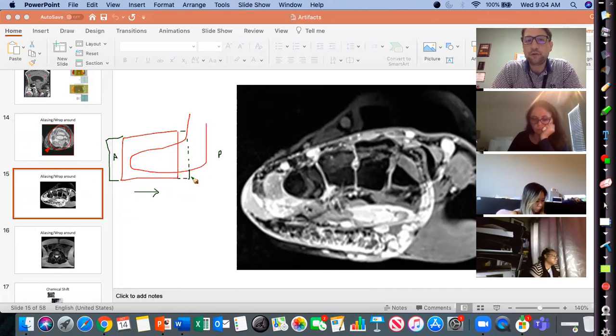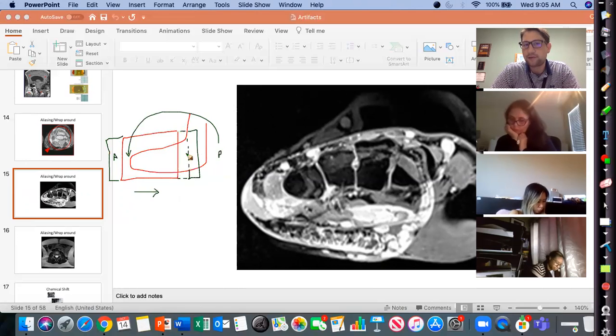All right, so if you have 25%, and then you have 25% on the other side, you can almost double that here, it's still not enough, because that heel, we're still getting signal from this area that's going to wrap into our image, okay? So you always basically have to just clear the anatomy. So with a Siemens scanner, just make sure the two combined on either side clear the anatomy in that direction, or else it's going to wrap into our image.